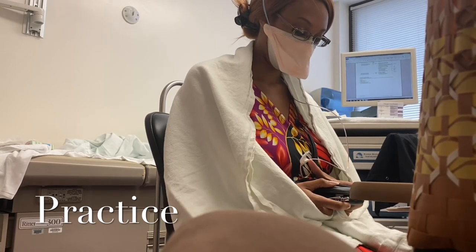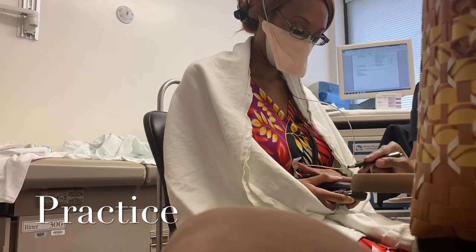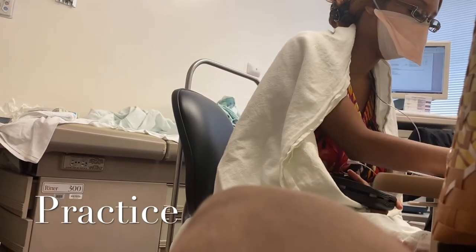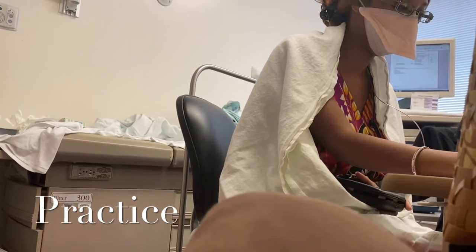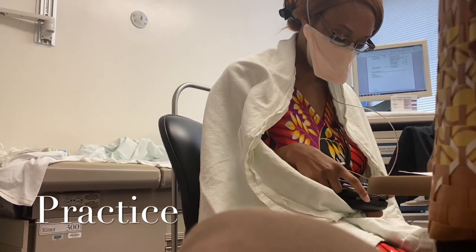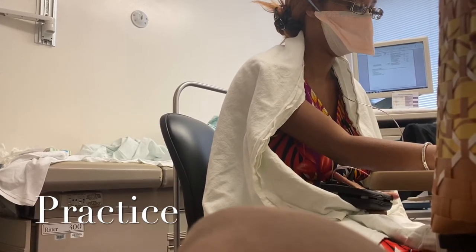Now we're going to practice like you're eating. This is your eating button. Start eating, finish eating. Just practice those. Push that, please. And see how it displays it there? What time does it say? 14:24. You see it's military time, so please put 14:24 here. And then you'll go over and put a check mark by your meal here. And then you eat. So the whole time you're eating, it's like that. When you finish eating, please turn it off by pushing down. And it goes away, good. And then you write down the time you finish. Any questions on what you're going to do for eating?